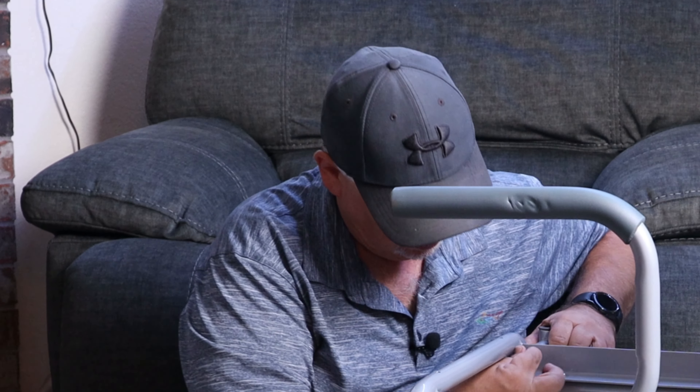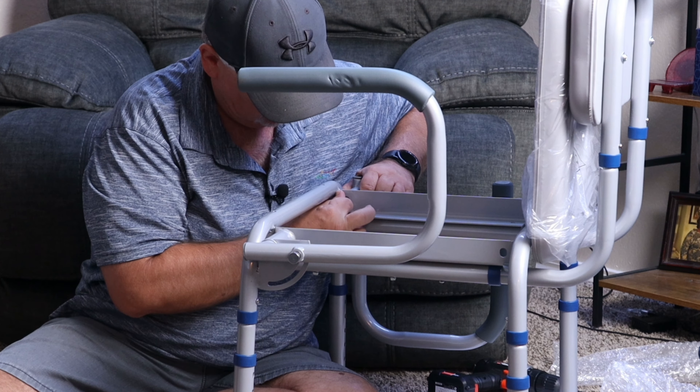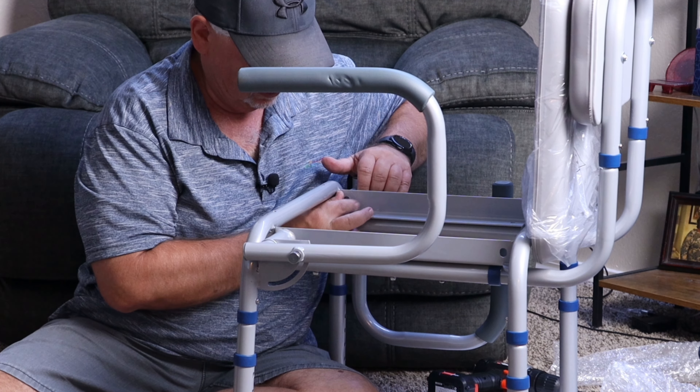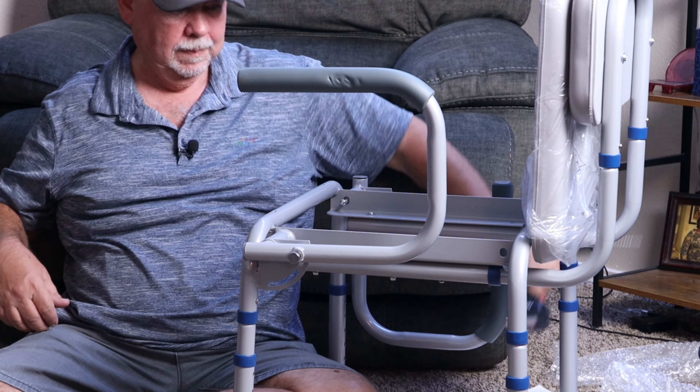It's got this blue stuff on it — I guess it's kind of like a glue. It keeps it from unscrewing. So once you get it started and get in there a little bit, it's pretty hard to turn. You can turn it with the Allen wrench, it's just a lot of work with that. So like I said, if you have other tools to use, I'd suggest using them.